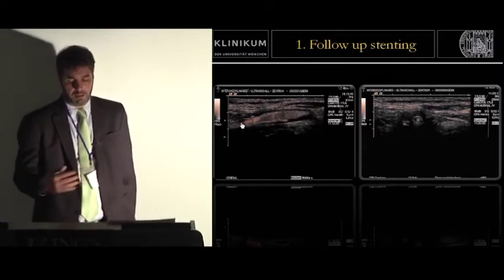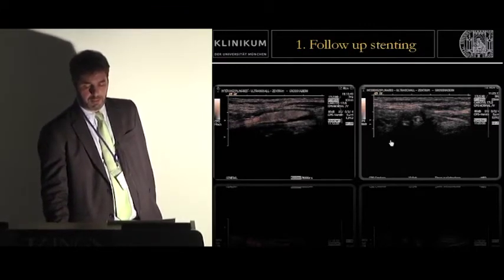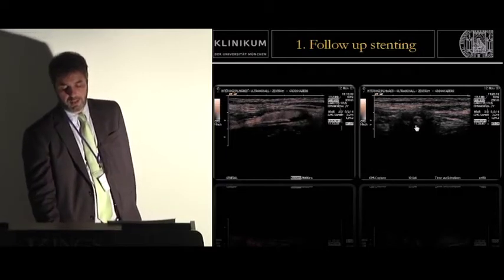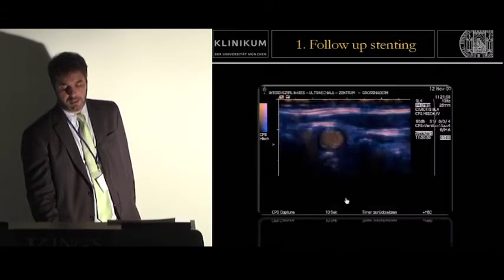If I repeat the examination with contrast, you see that here something is missing. Normally, contrast should fill the complete stent graft. Also, if you look at the axial plane, about 50% of the perfused lumen doesn't show any contrast uptake here.